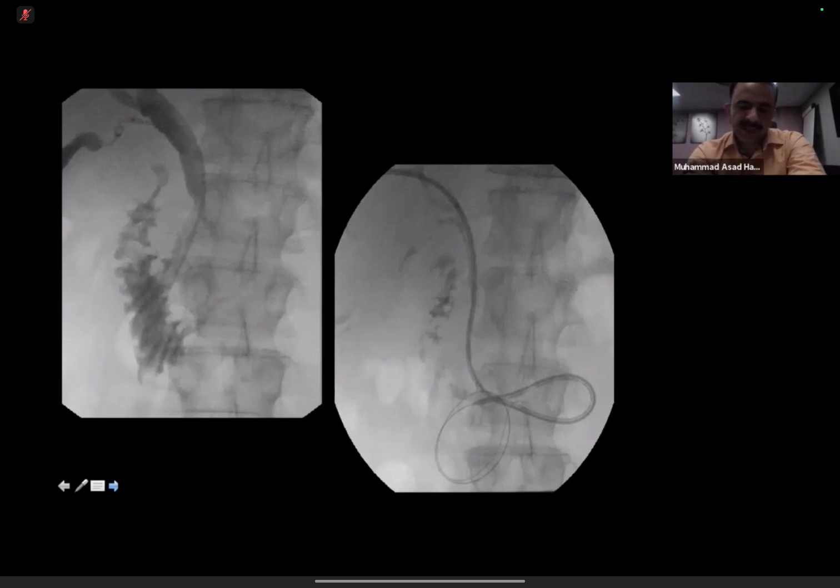Okay. The difference between the biliary drainage catheters and the other catheters is that, especially if you have gone across the area of occlusion or stenosis into the bowel, as you can see on these images, this is called an internal external drainage catheter. The reason it is called internal external is that it has a set of holes right towards the tip of the catheter, and then another set of holes up to about 8 to 10 centimeters.